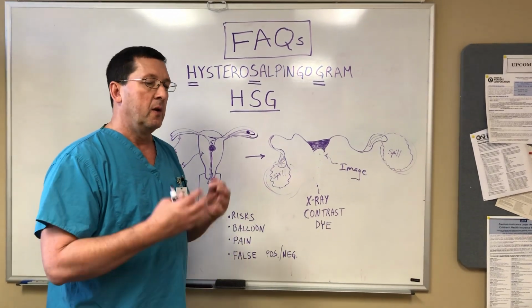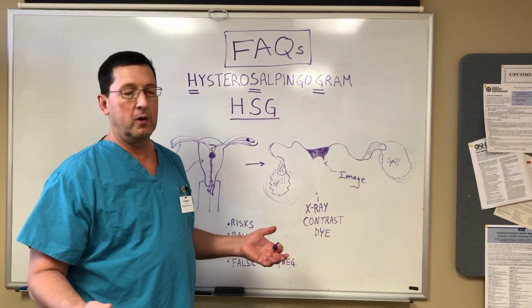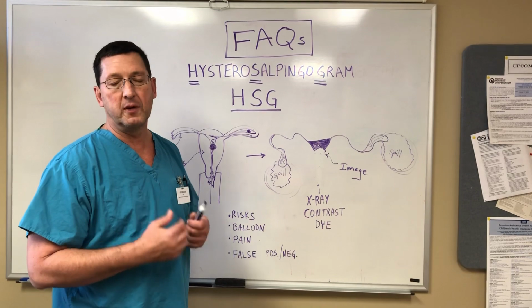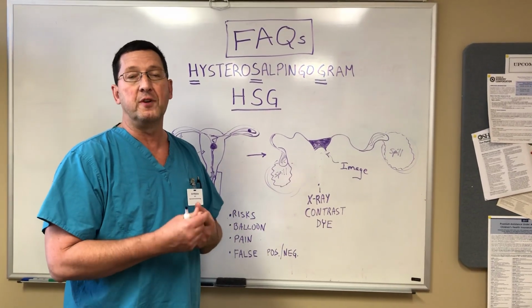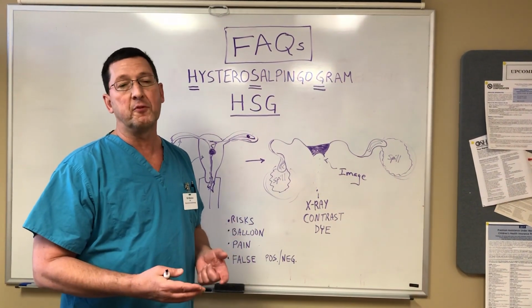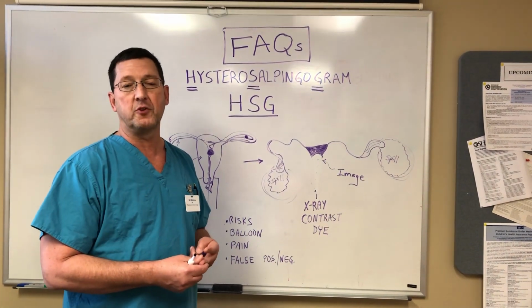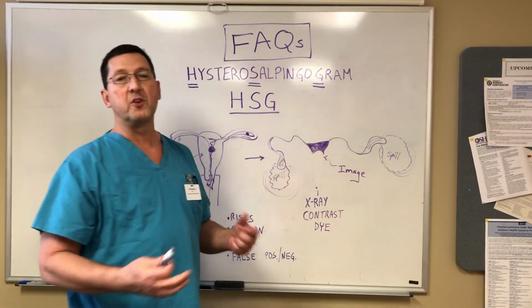Now, women hear about this study and they hear, oh my God, it was so painful. Well, it generally is not when I do it. Some of the reasons for pain is one is there's a doctor who's not comfortable doing this procedure. Sometimes radiologists do this procedure. They're frequently not comfortable doing this kind of thing. It takes them long. They don't have the tricks of the trade. And they're trying to put balloons up here, which causes its own pain.